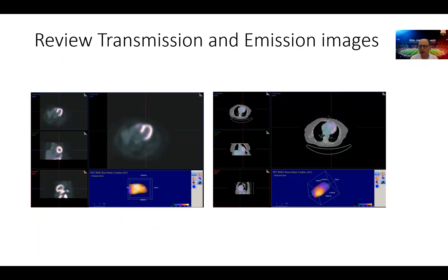We start with the first set of images. On purpose here, I made the rest transmission and emission images a little bit favoring the emission images, just to show you where the heart is and how these things go over the CT.